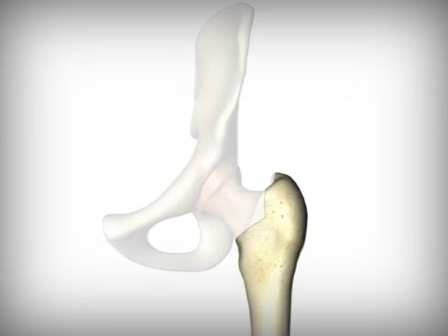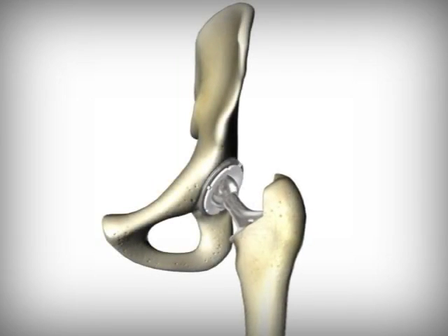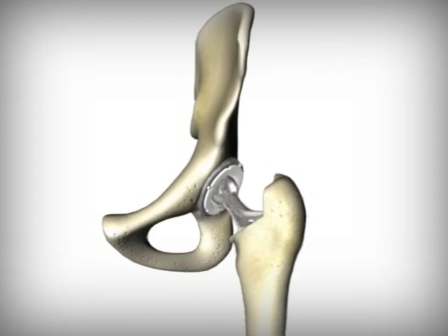In hip replacement surgery, the ball of the thigh bone is replaced and the socket of the pelvis is resurfaced. Just like a healthy hip, these implants have smooth gliding surfaces that allow easy and painless movement.